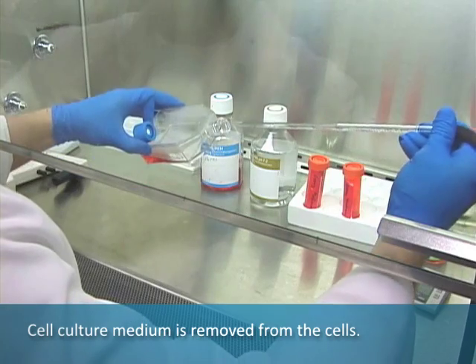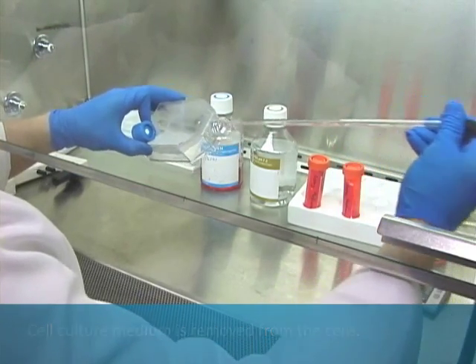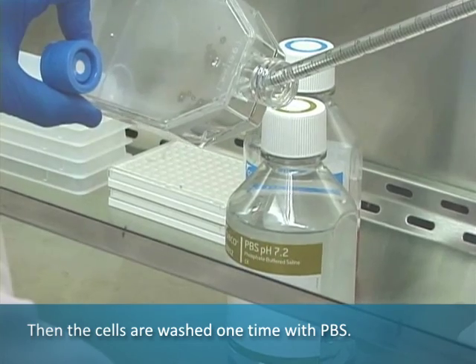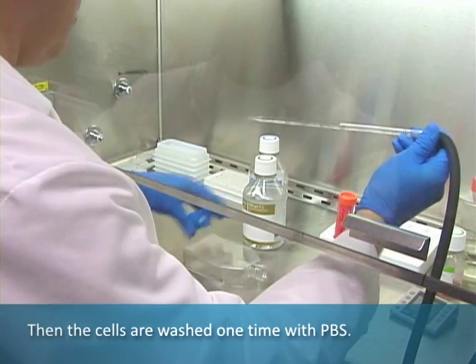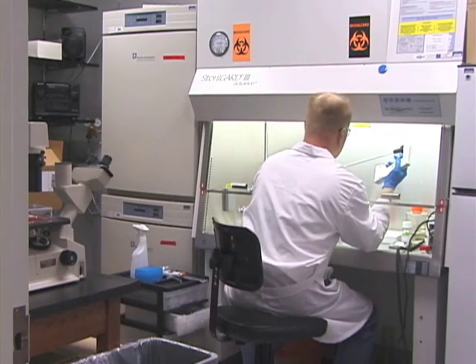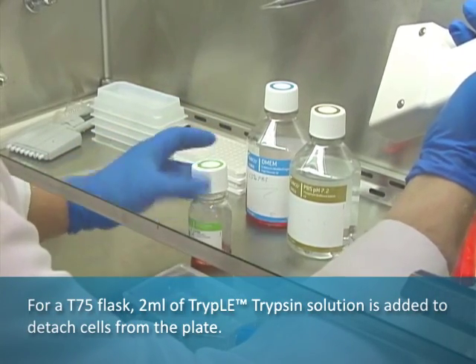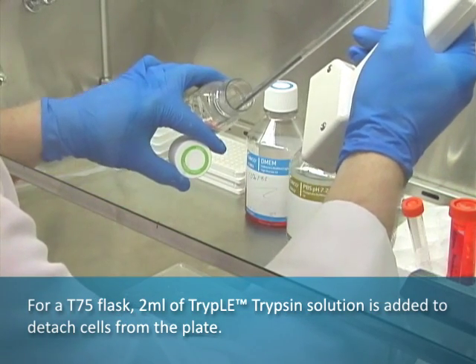Cell culture medium is removed from the cells, then cells are washed one time with PBS. For a T75 flask, two milliliters of TripLE trypsin solution is added to detach cells from the plate.